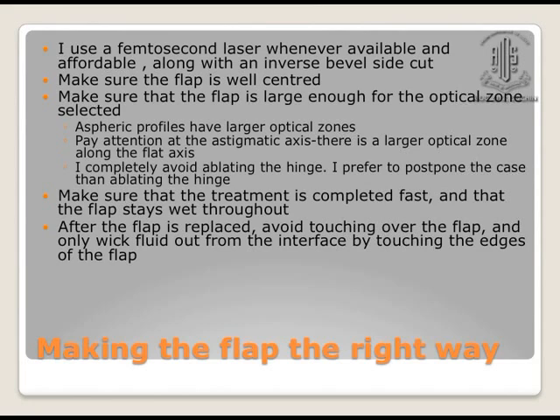Make sure that the treatment is completed fast. So once you open the flap, you should not wait too long, otherwise you would have a refractive problem, and the flap may become very dry.